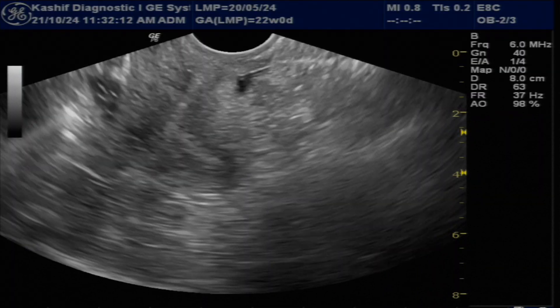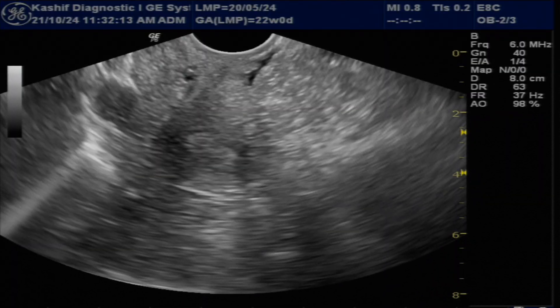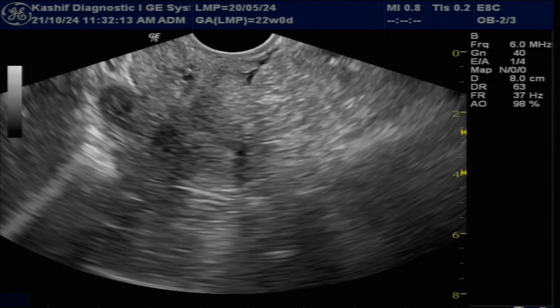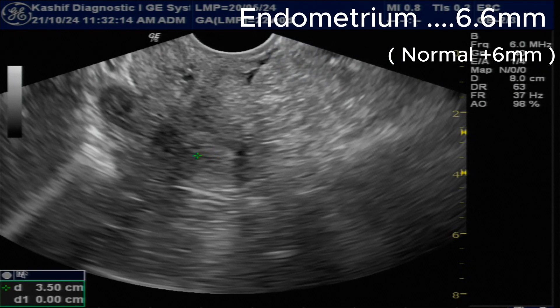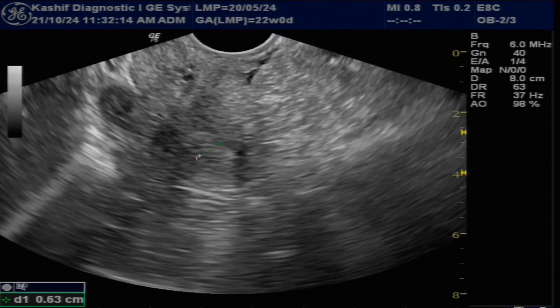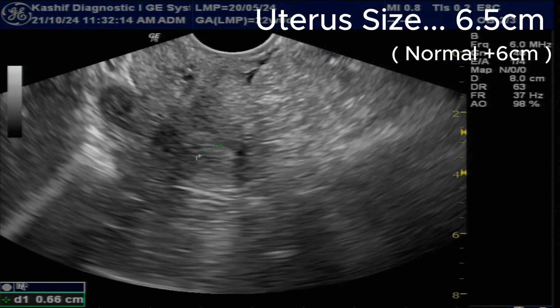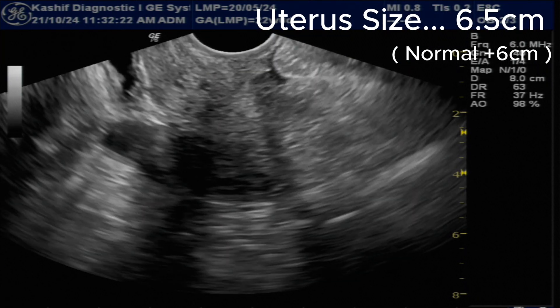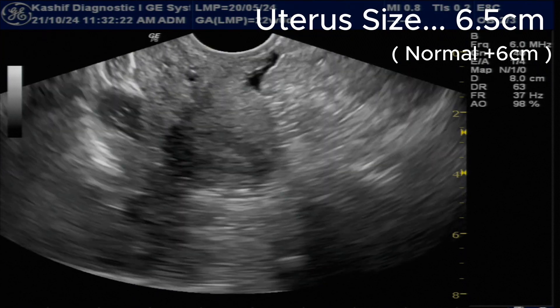This is the uterus. The uterus is normal. The endometrial thickness is 6.6 mm, which is normal. The uterine size is also normal at 6.5 cm.